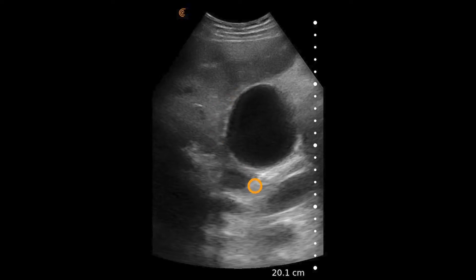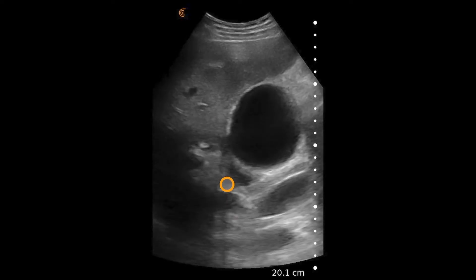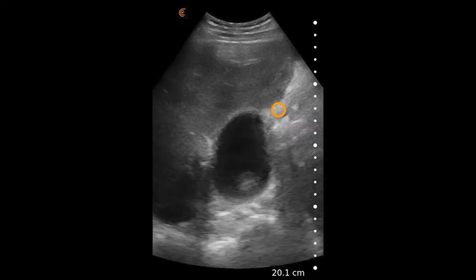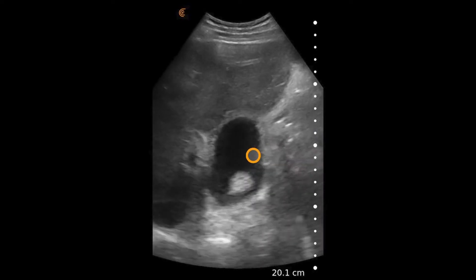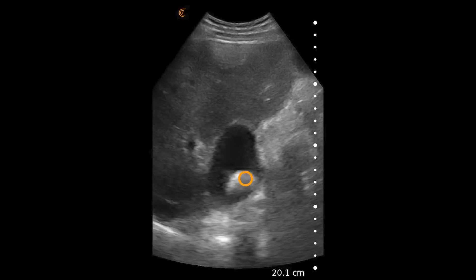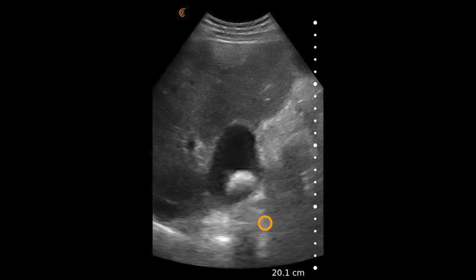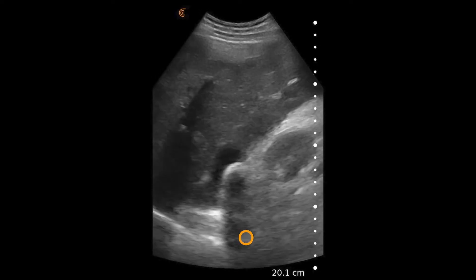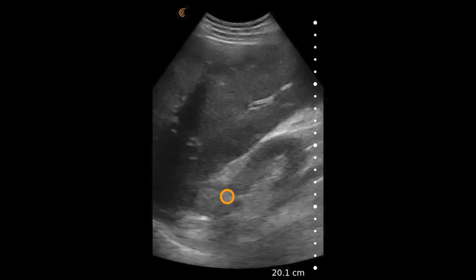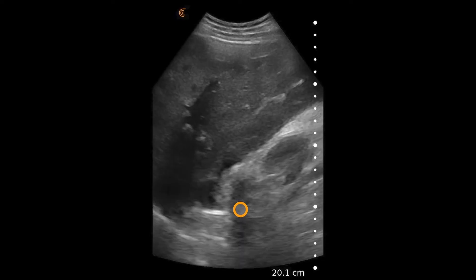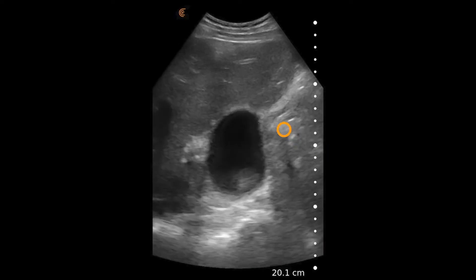There is thickening of the gallbladder wall and pericholecystic fluid. As the scanner goes down towards the neck of the gallbladder, there is an obvious gallstone as evidenced by this acoustic shadowing here with a bright circular structure and the shadowing behind it, evident of a gallstone that likely is lodged in the neck of the gallbladder.